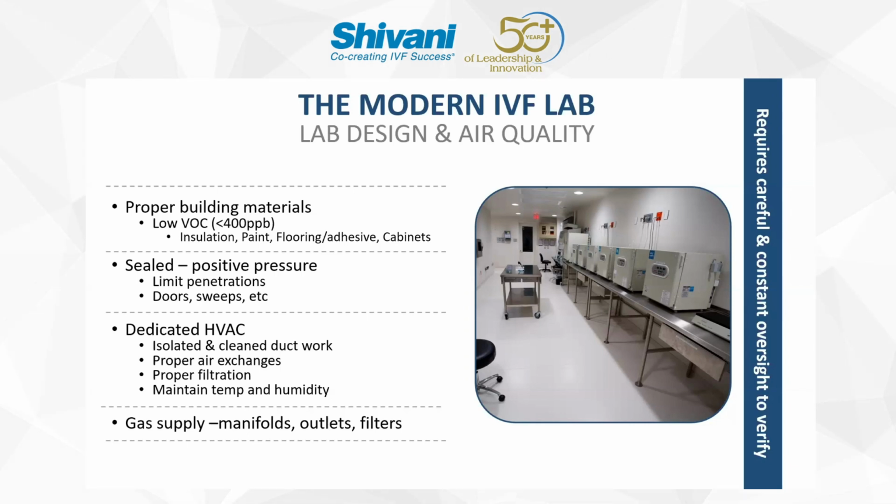Cleaning the ductwork: you don't want to spend all this time and energy designing and building this lab to then put in ductwork that's dirty, covered with oil, VOCs that are now blowing into your lab. Proper air exchanges, proper filtration, whether it's a HEPA filter or a carbon filter, a permanganate filter, or a mixture of these. There are different combinations of filters to address a particular local issue that may exist depending on the outside air quality or the local circumstances. And then having a system that ideally can maintain a stable temperature, and as we've talked about here, humidity, if that happens to be an issue.